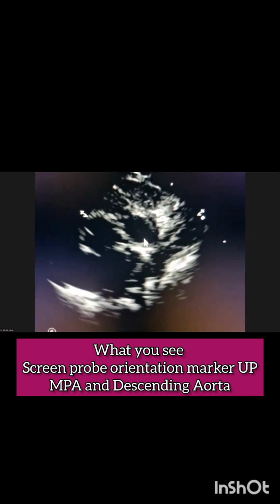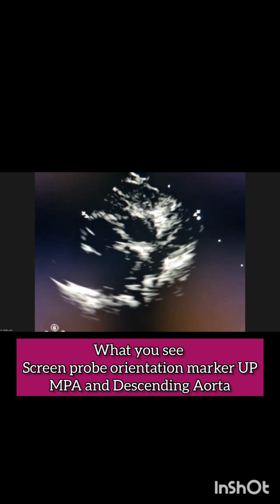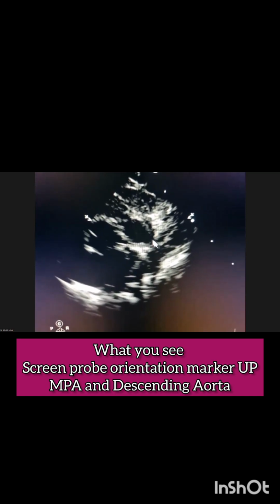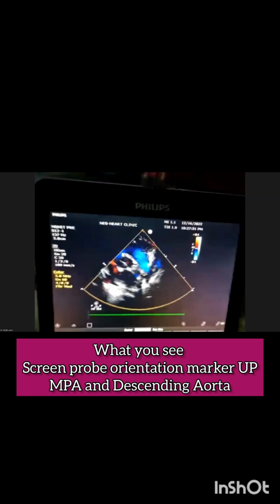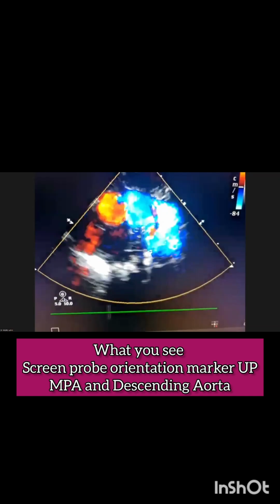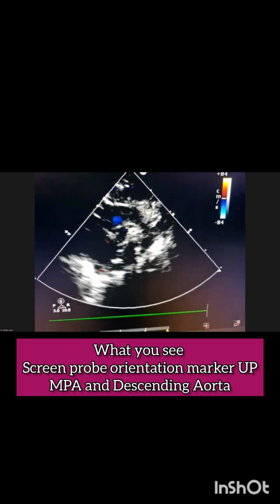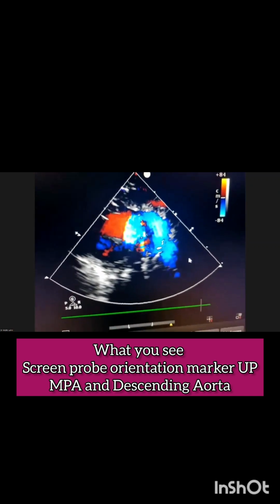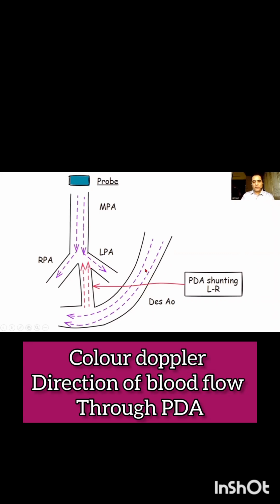So if there is a PDA, then the PDA will be from the descending aorta and go up and join the main pulmonary artery. When we put a color, you will see the two blue colors. One blue is the MPA flow, another blue will be the blood flowing through the descending aorta. If there is a PDA and shunting left to right, it will be red. If it is shunting pure right to left, it will be blue.